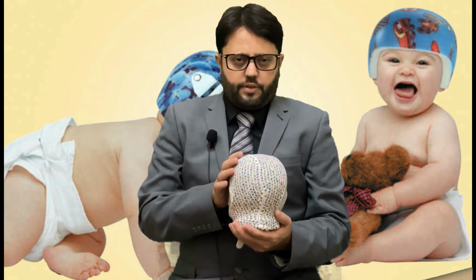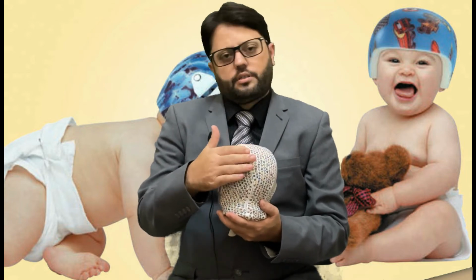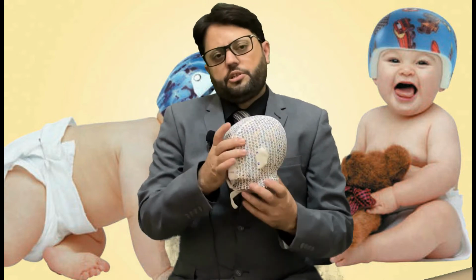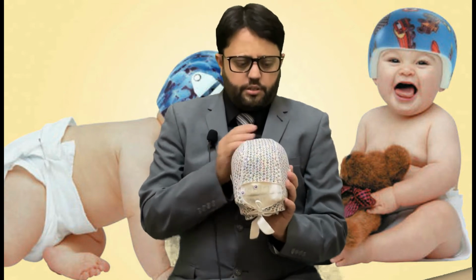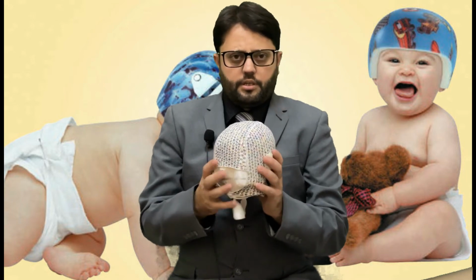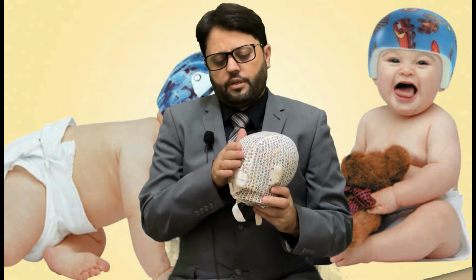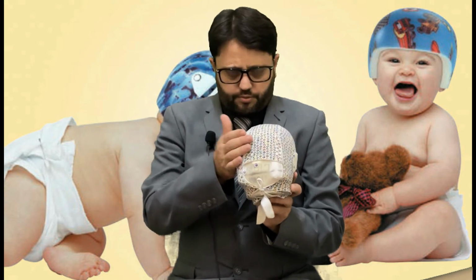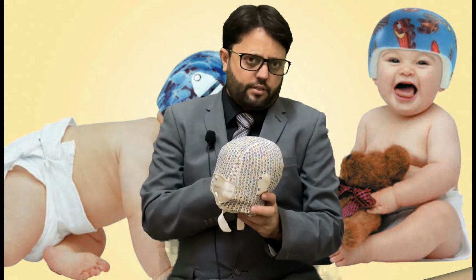In case I show you another model, the back side of the head is flat. It can be on the right side, it can be on the left side, with a combination of the anterior. There is a possibility that only the posterior quadrant is affected and there is no problem with the forehead shape. But there are also chances that the forehead is very pronounced on one side more than the other. It can be the same side as the flattening on the back.